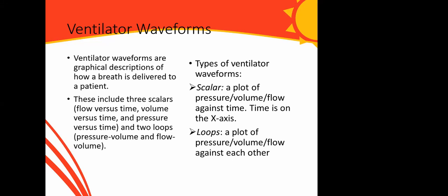When we were training, we didn't have the privilege that we have now to look at the ventilator waveforms, especially as it helps us to diagnose some of the problems that we may encounter in ventilating our patient.